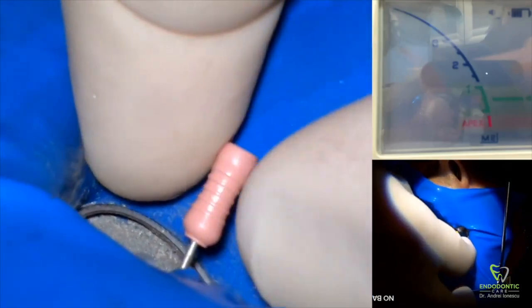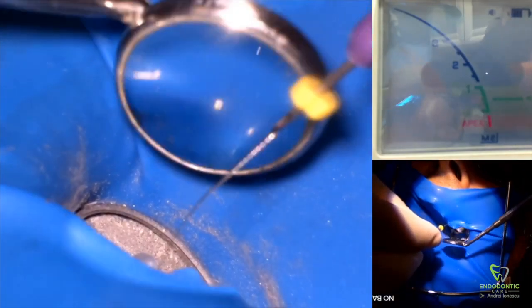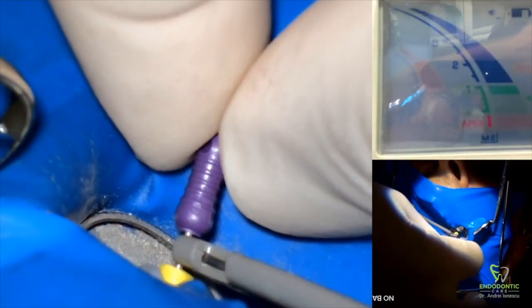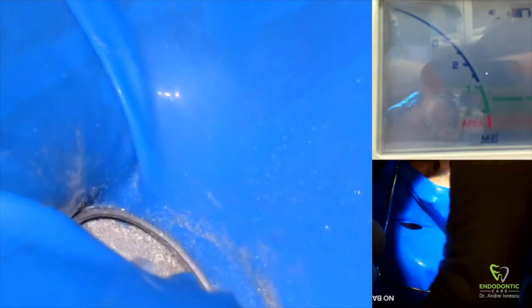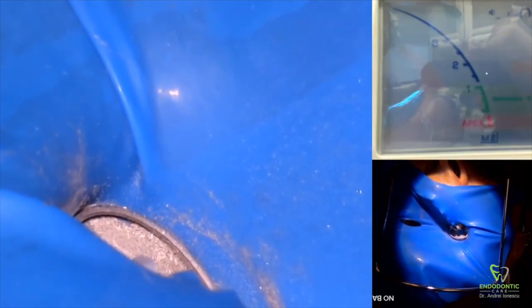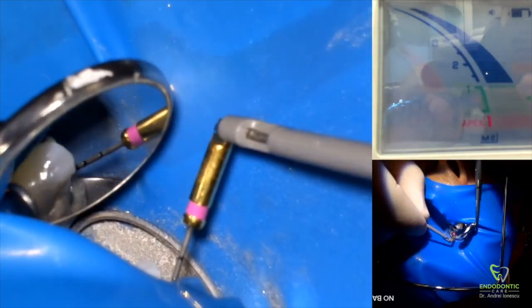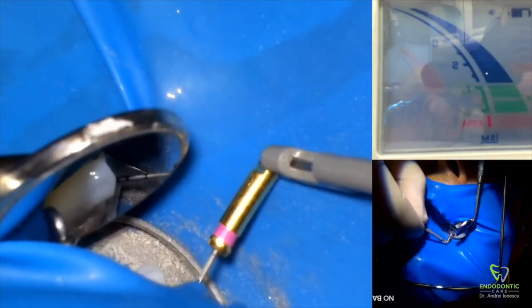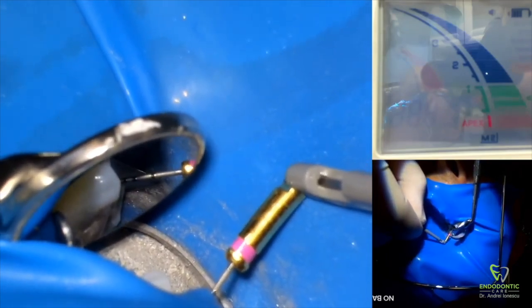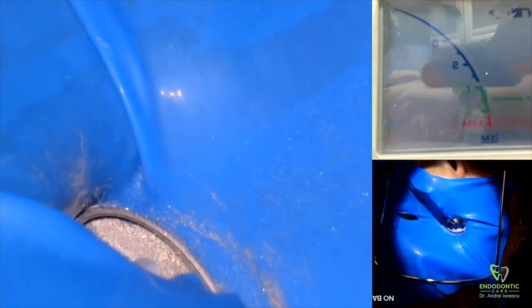We'll do the same for the palatal canal, but in this case the palatal canal is patent. The 10k file ends up being a little too loose for an accurate measurement, so instead I'm going to use a path file — a number 10 path file hooked on directly to the apex locator. I give credit to my colleague Ted Damas for this technique — he taught me this and it's worked wonderfully. This is the most accurate way to obtain a reading once the canal is large enough that the path file can pass freely through the apex. I can see my reading is exactly 19mm.